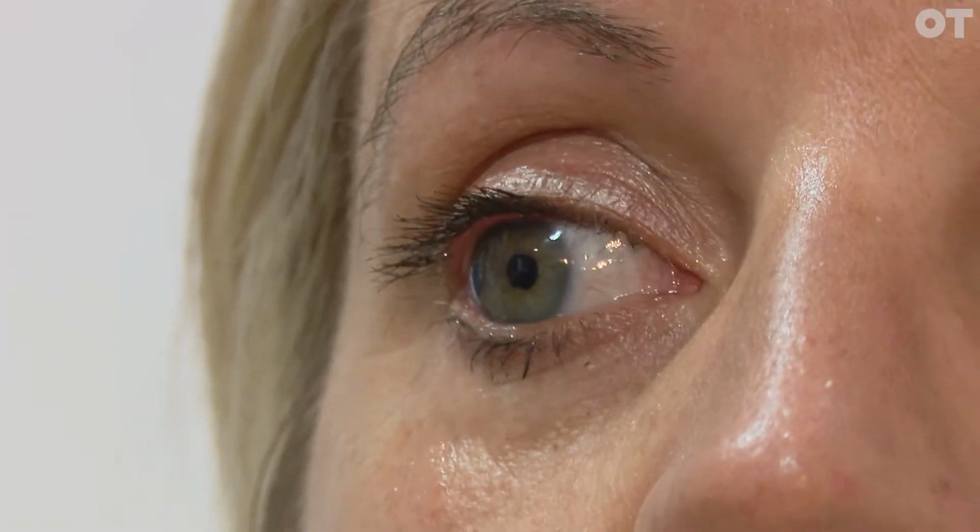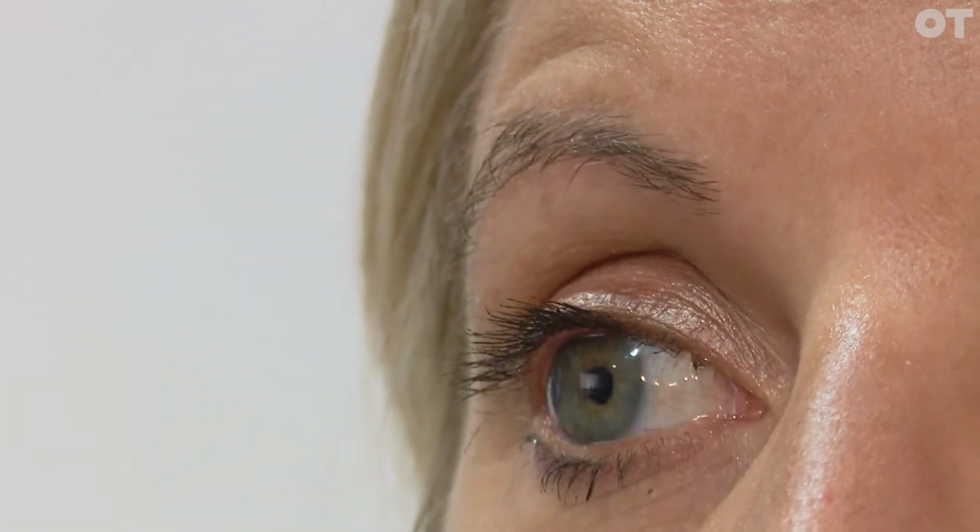When they come for the aftercare, you're not just looking at that eye and seeing, okay, is that eye as happy as it was when I first fitted the lens? There's a number of things you're going to be looking at and putting your fluorescein in, but it's also that first touch point since they went away with the lenses. So you need to troubleshoot. Are they having problems with anything? Is there anything that they've forgotten that they might feel silly asking again, because you did tell me but I've forgotten?